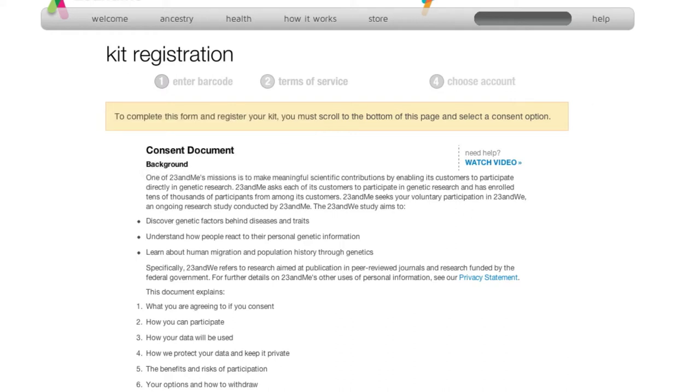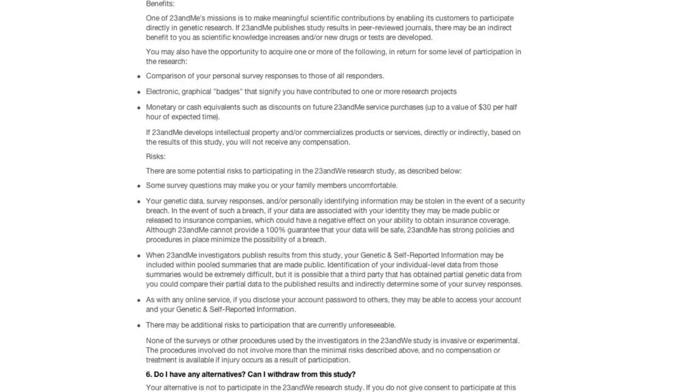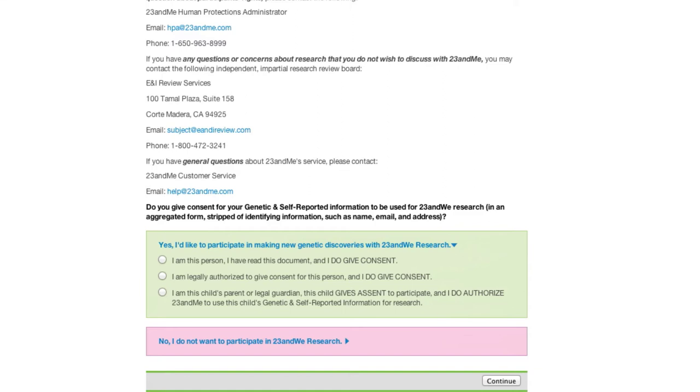Here's the consent document. You're allowing them to basically process your DNA and obtain information about your genes, etc. Of course, all of this will be confidential unless you choose to make it public. I'm doing this on behalf of my dad, so I'll choose the second option. If you're the first person, you would choose that option.